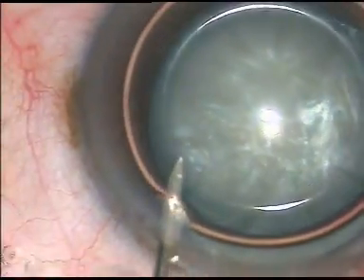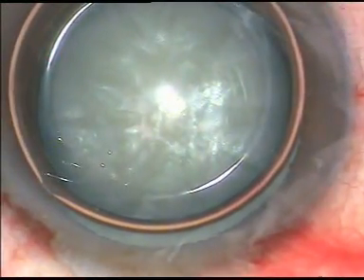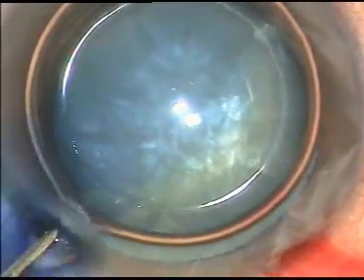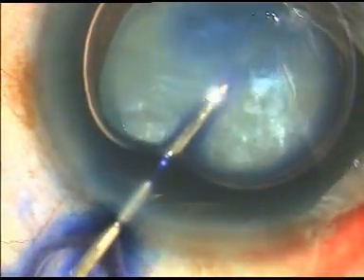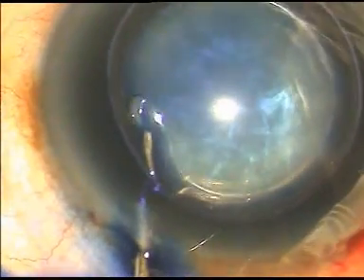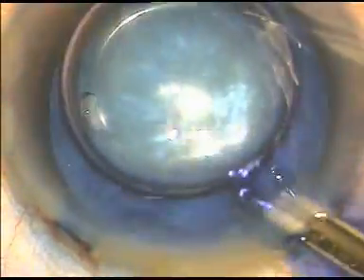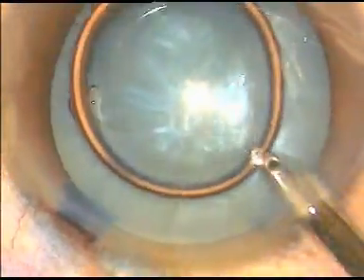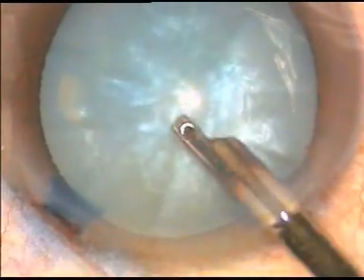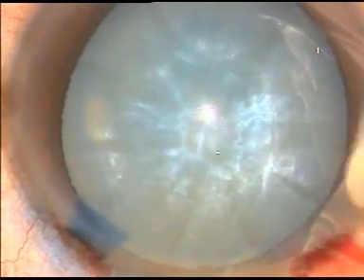A big air bubble is injected into the anterior chamber. Trypan blue dye is taken to stain the anterior capsule so that we can perform capsulorrhexis easily. Staining is done with a sweeping motion. Immediately after staining, I wash out the dye. I do it under an air bubble because I don't want the endothelium to stain with trypan blue dye.